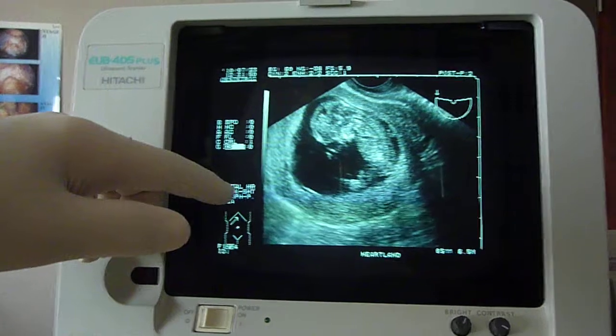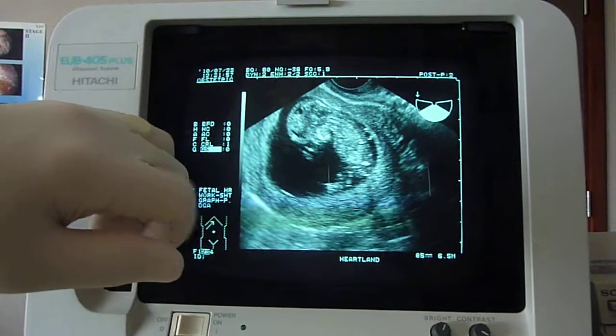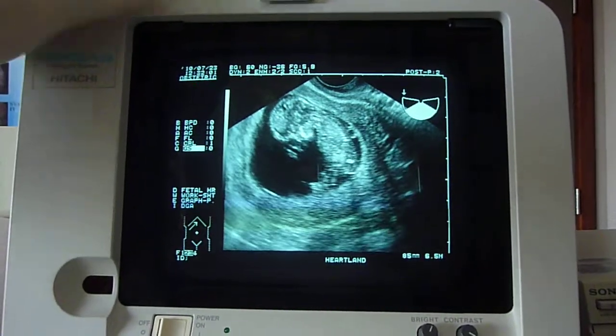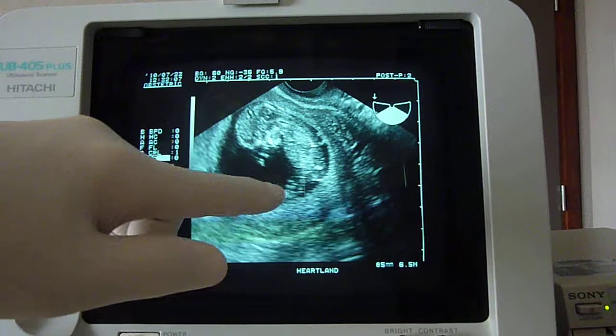So this is a picture of the baby, and you can see the fetal heart beating right there. I'll move my finger out of the way — you can just see a nice little flickering going on right there. This is a nice profile: that's the baby's head, this is the heartbeat, the abdomen, and these are the feet down here.